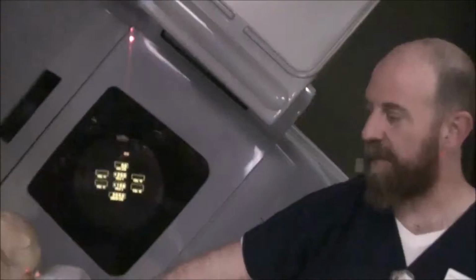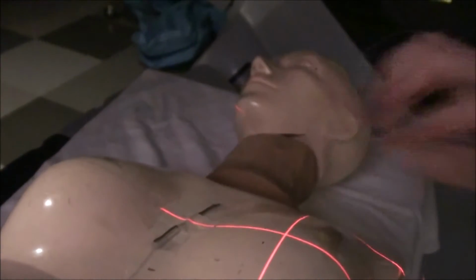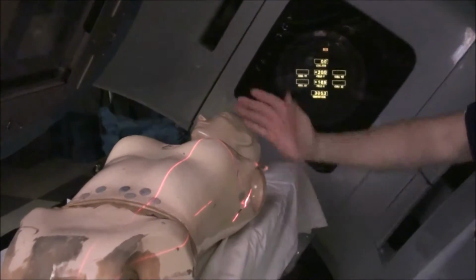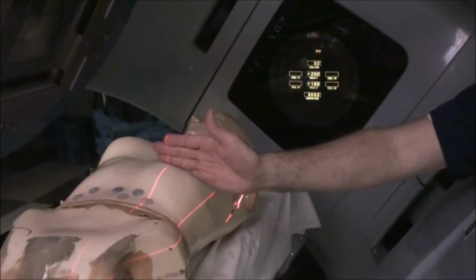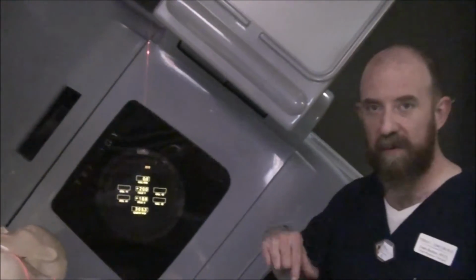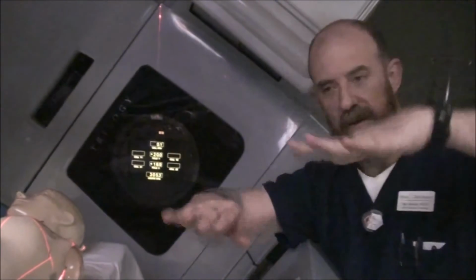Now, if we have the back pointer laser running right across this wire, and you have your CR running right across this wire, we know we're going to be pretty stinking close. So, we've got our ballpark, we've got our wires, we've got the doctor's marks, we've gone from the sternoclavicular to the flash to the flash. Now we need to go fluoro. So we're going to go out of the room, we're going to fluoro, and we're going to look at these wires and make sure that they are superimposed with each other.